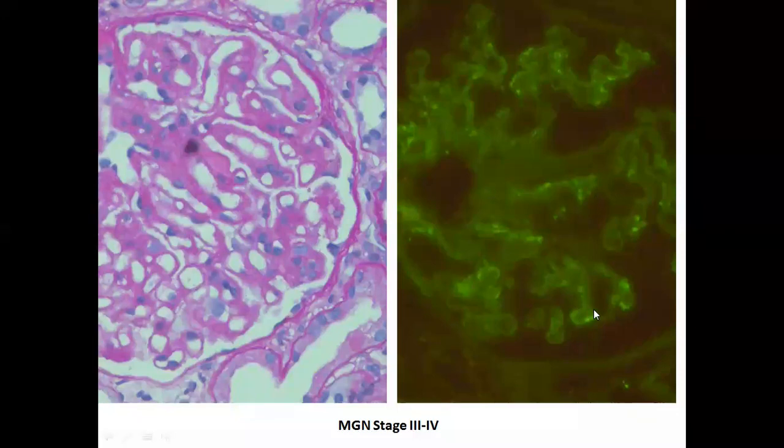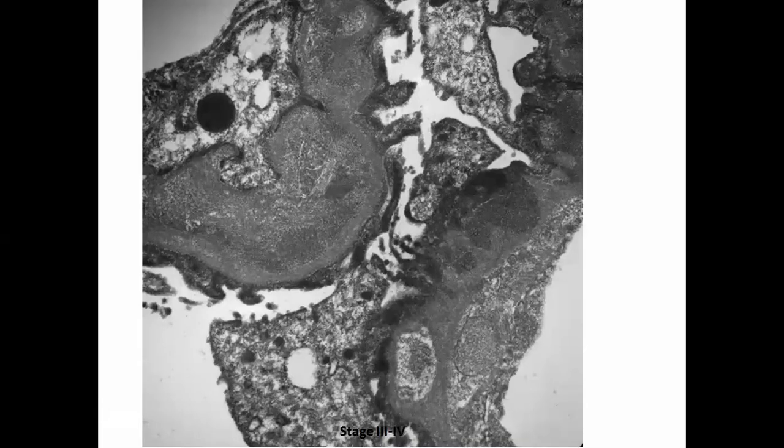So whenever I say these are immune complex deposits, that means they will have a granularity. So you can see these dot-like structures. So that means there is some granularity to it. It is not like a linear staining which you see in anti-GBM disease. So you can see these dot-like interrupted granular staining. So presence of interrupted granular staining means that we are dealing with immune complex mediated disease. So when I say interrupted granular, I have shown you ultrastructure examination also of a glomerulus, where the subepithelial deposits are not uniformly placed. They are arranged in an interrupted manner on the GBM.